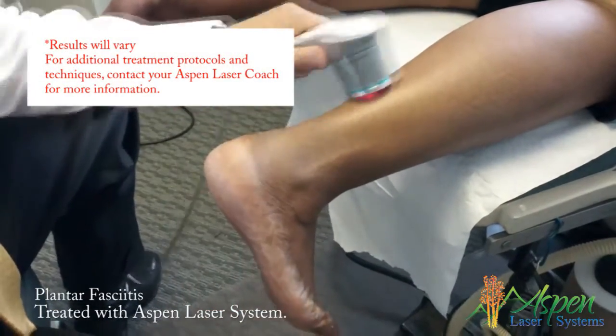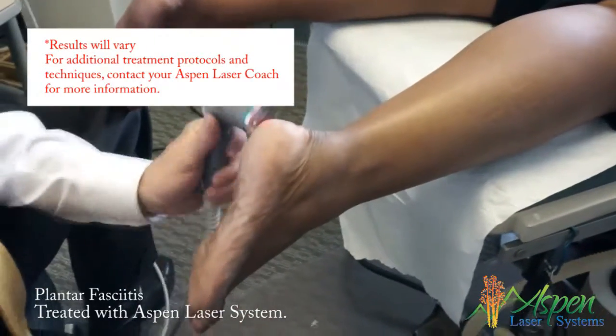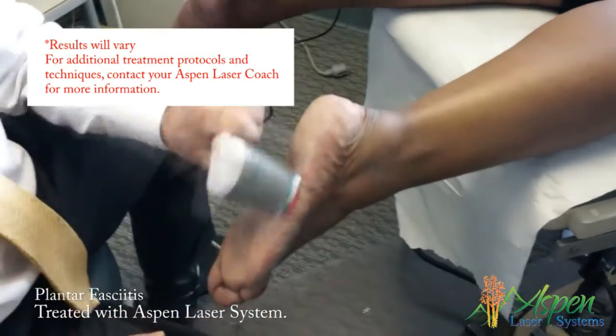We can also address sesamoiditis, neuroma, and neuropathy with this. But the two big ones this is really effective for are Achilles tendinopathy and plantar fasciitis.